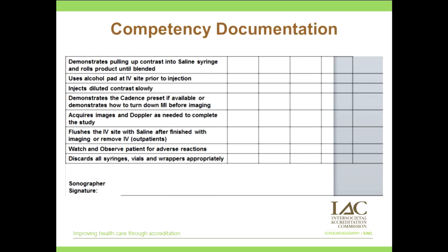This is all one page, but I couldn't get it on one page for you. Well, I could, but the fonts would have been so small. So we did it this way. Demonstrate pulling up contrast into the saline and rolling product until blended. Using alcohol pad at the IV site, injects diluted contrast slowly. Demonstrates knowing the right presets, turning down the MI, acquiring images and Doppler as needed to complete the study.